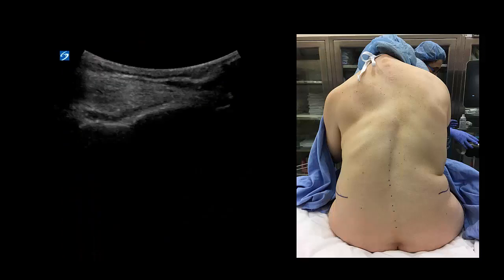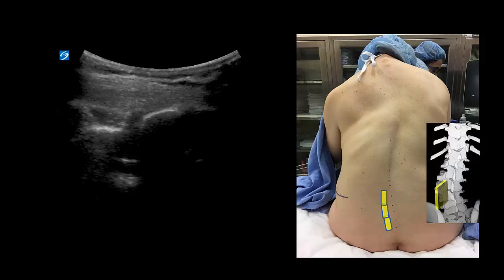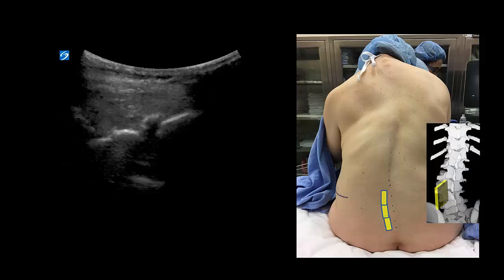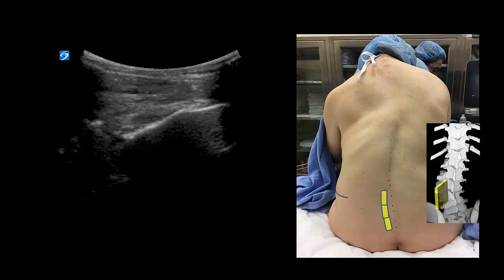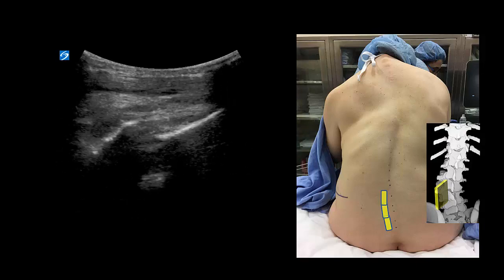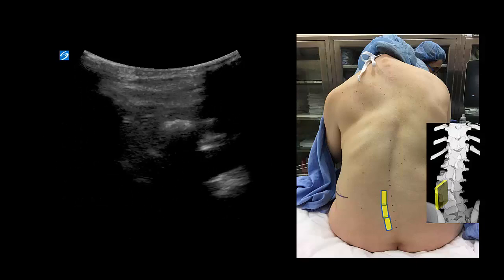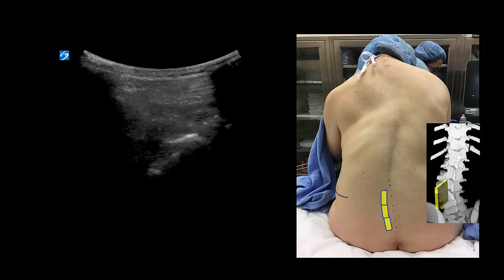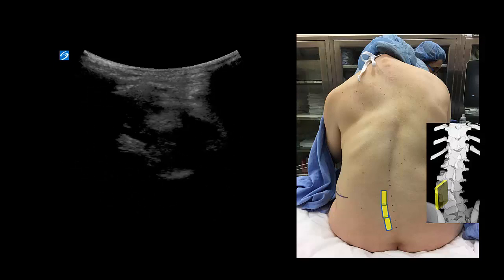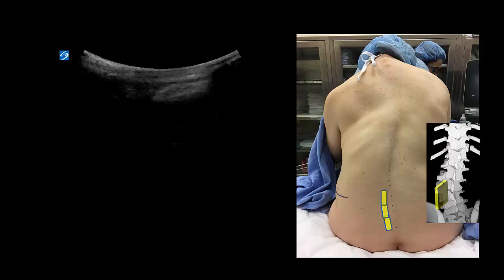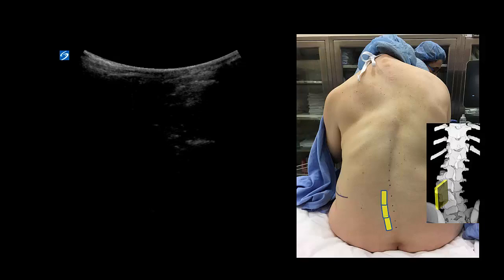This video shows the parasagittal oblique scan obtained on the patient's left side. I generally always start over the sacrum, which is recognizable by its flat linear hyperechoic appearance. As the probe is shifted and angled medially, a break appears - this is actually the first sacral foramen, not the L5-S1 intervertebral space. This is the L5-S1 space, with the L5 laminar sawtooth shadow clearly visible. L4-5 and L3-4 are all decent-sized spaces with clearly visible anterior complexes. However, a parasagittal oblique view of the L2-3 space is much harder to obtain in this patient, as this is where her curve is maximal.